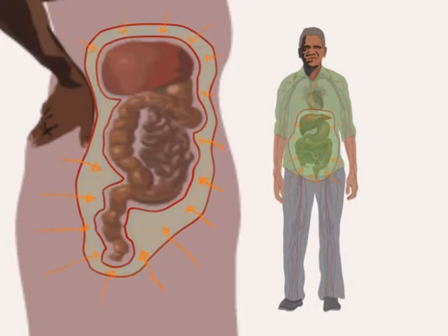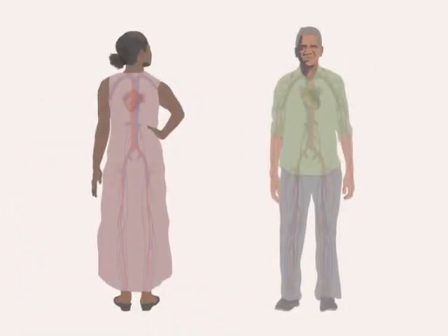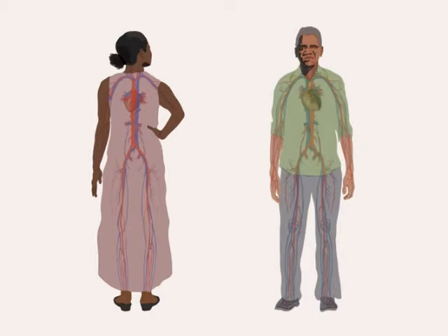The rubbish in your blood passes through the thin skin and goes into the dialysis water. After the rubbish in your blood has entered into the dialysis water, you let it go out of your peritoneum. This is how peritoneal dialysis cleans your blood.